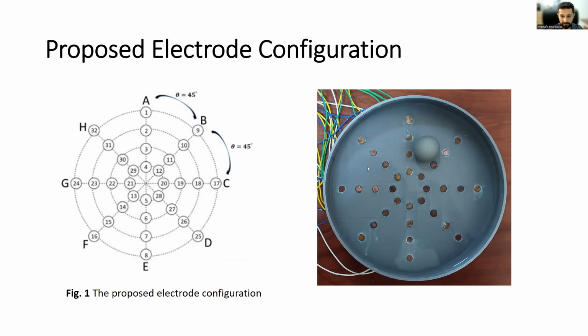In each measurement cycle, an alternating current is injected between the first and the last electrode of a line, and voltages are measured from the remaining electrodes with respect to the current sink. This configuration rotates through 8 directions spaced at 45 degree intervals, resulting in a total of 240 voltage measurements. It provides multi-angle impedance data similar in spirit to what computed tomography does with X-rays, except we use current flow, of course.